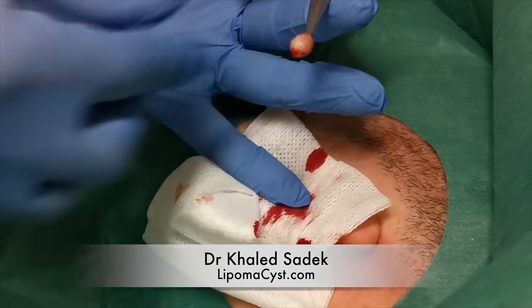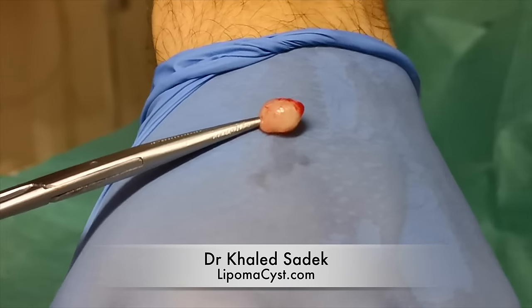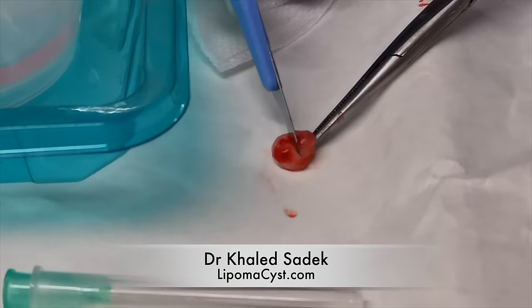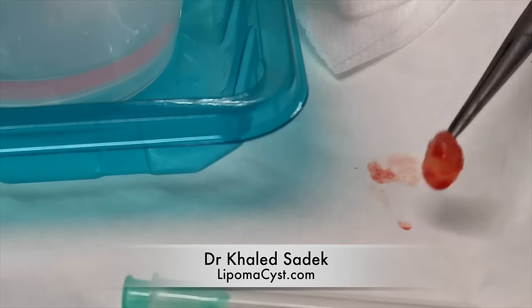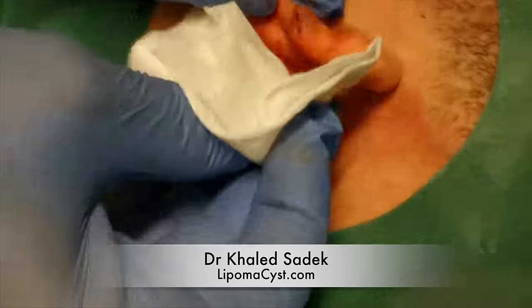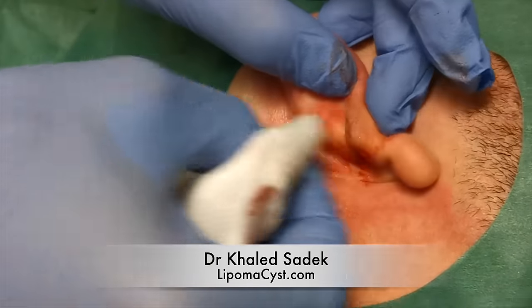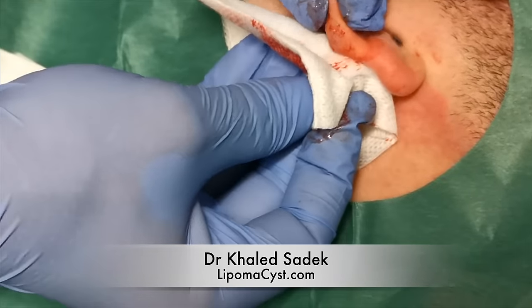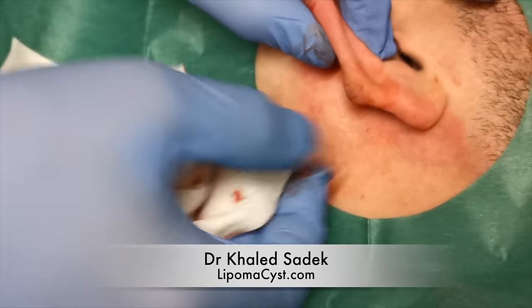Okay, so that's the cyst out in its entirety. I'll just show that to the camera — let's bring it over to the table here, chop it up and see what's inside. It's absolutely solid — calcinosis, gritty. That's interesting. Okay, let's go back to the ear. It's looking very nice actually — much of the skin looks like it's coming together quite nicely. Might be tempted to just leave that as it is, it'll heal nicely. Behind the ear where there's a bit of excess, let's do some trimming.